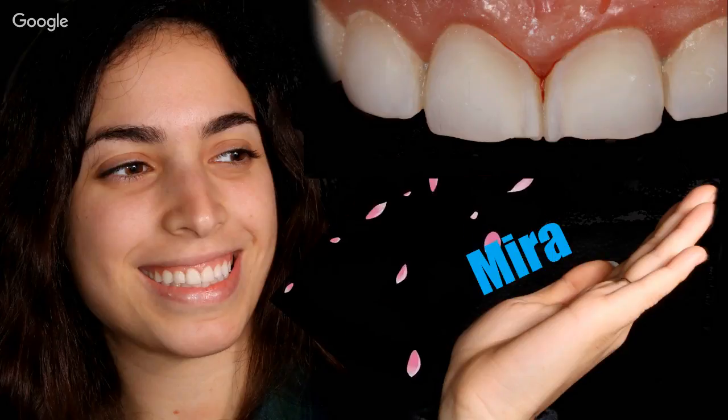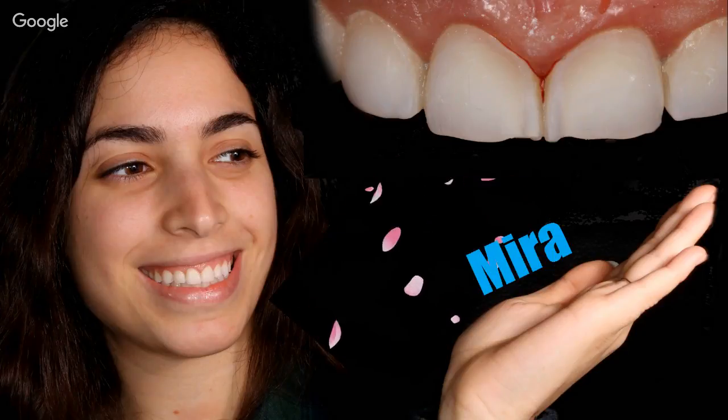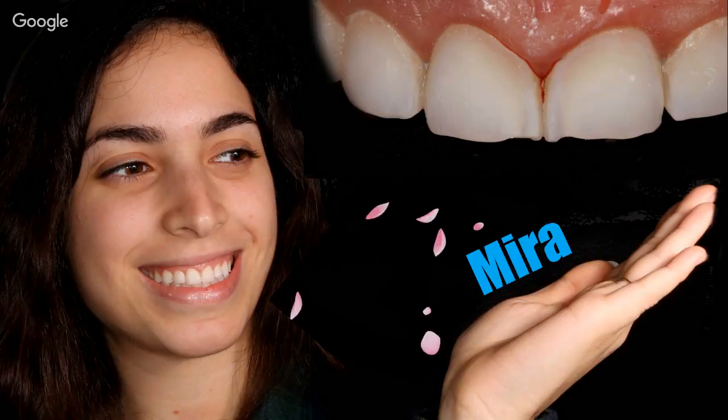It appears that the tooth is already prepped. You can feel that there's a finish line right there, but that's only because of the habit of lemon eating. It erodes the dentine much faster than the enamel, and you see some sort of a shelf, and you feel that this is prepared, but this is not prepared.